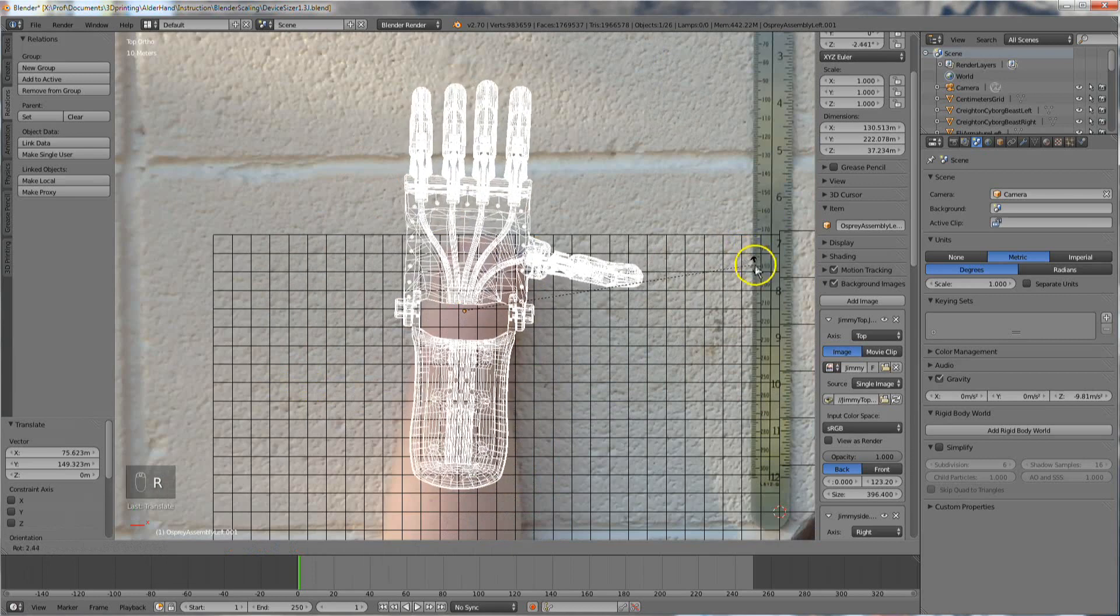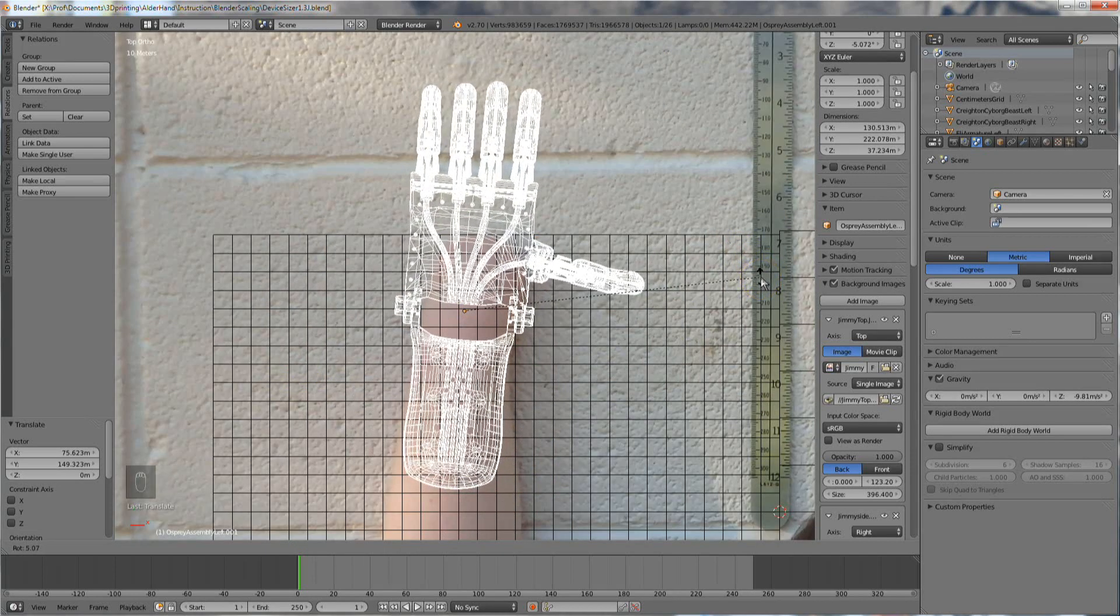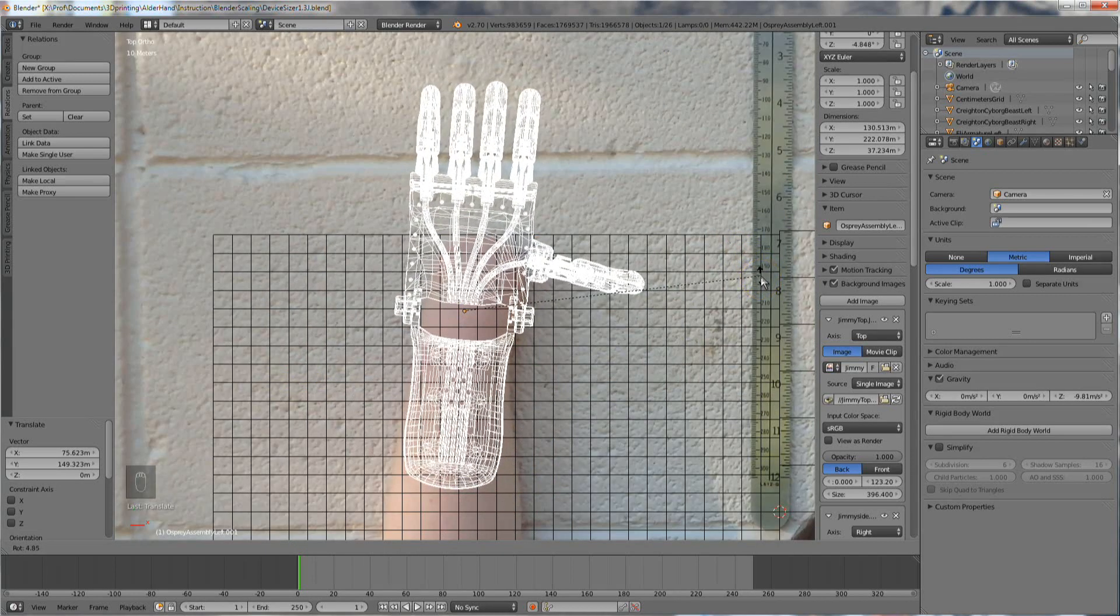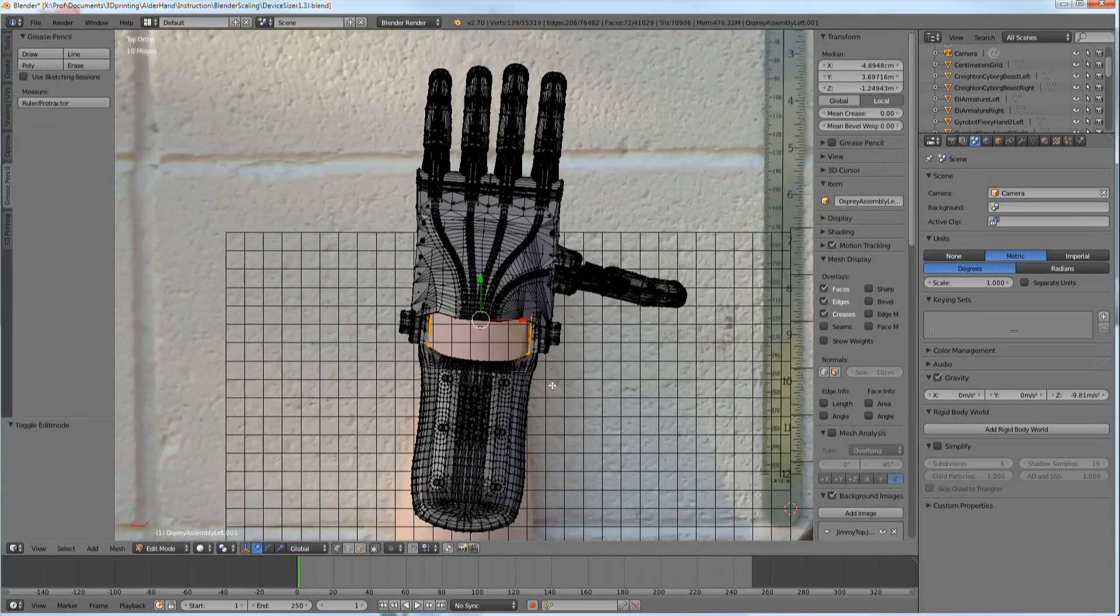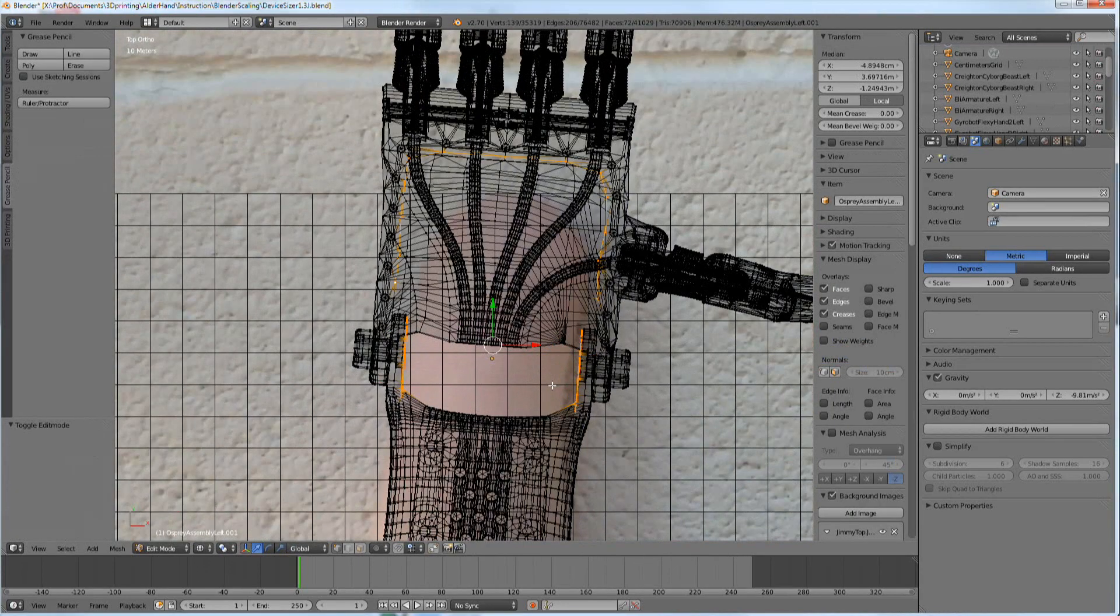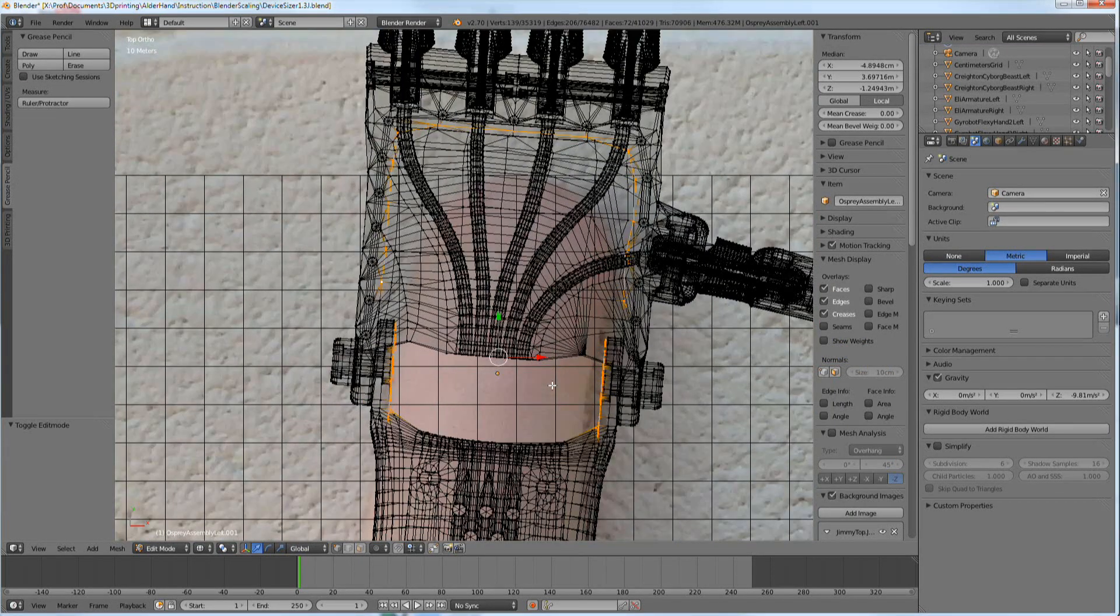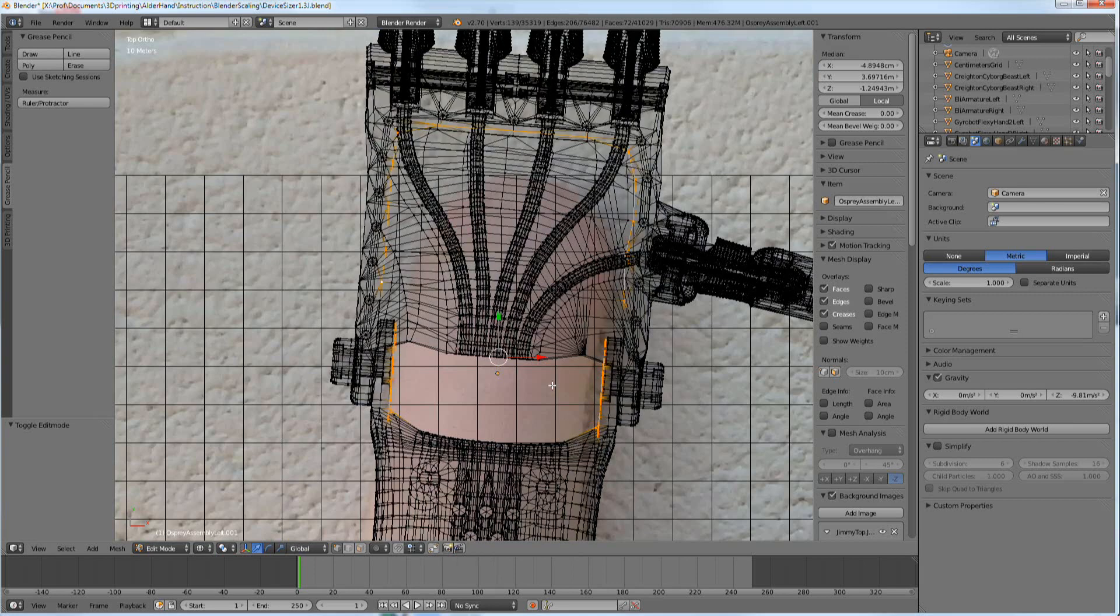You may need to hit R to rotate the device into the proper orientation. Since we're determining scale, we need to be especially aware of the internal size and shape of each device.